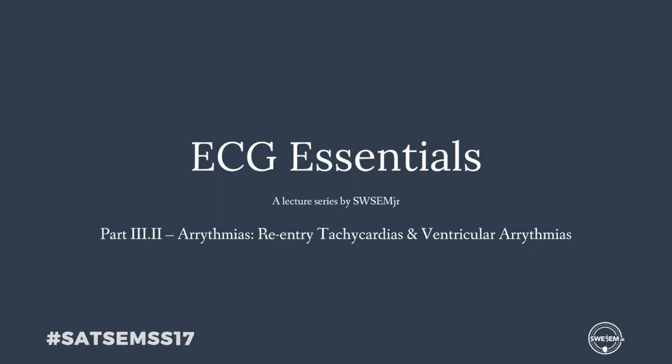This is part 3 where we talk about arrhythmias, and I would really call this part 3.2. In part 3.1, we talked about supraventricular arrhythmias such as SVT, AFib, and atrial flutter. Today, we'll be talking about re-entry tachycardias and ventricular arrhythmias. So, we're going to start strong and talk about re-entry tachycardias.